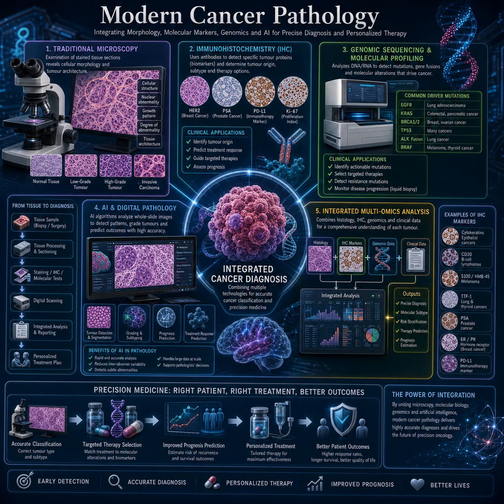The complete diagnostic pathway has therefore evolved into an integrated workflow. A tissue sample obtained through biopsy or surgery is processed, stained with H and E, supplemented with immunohistochemistry when necessary, analyzed using molecular and genomic techniques, digitized for AI-assisted evaluation, and finally integrated into a comprehensive pathology report.